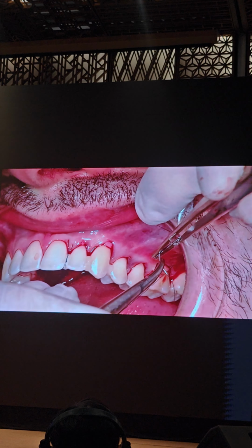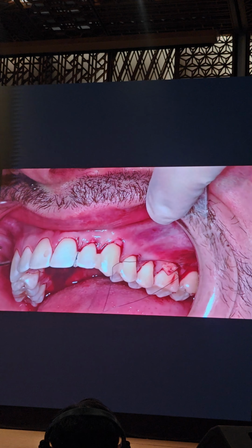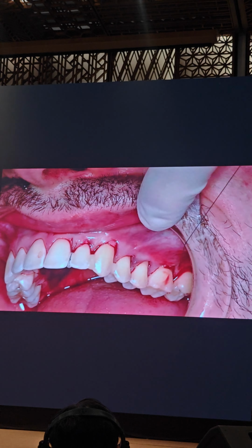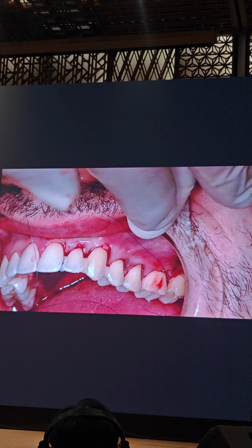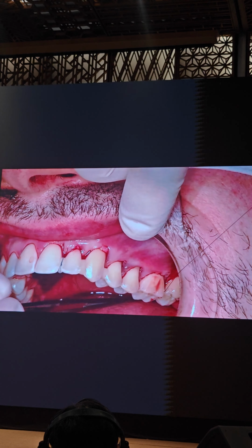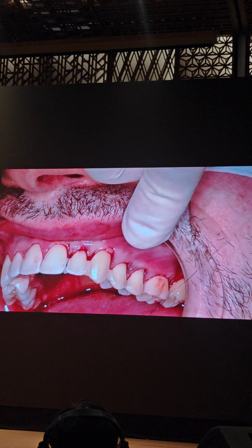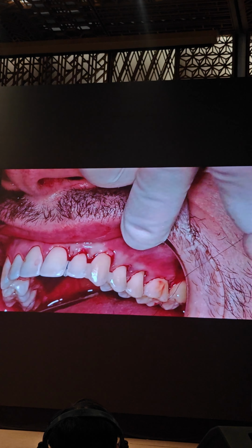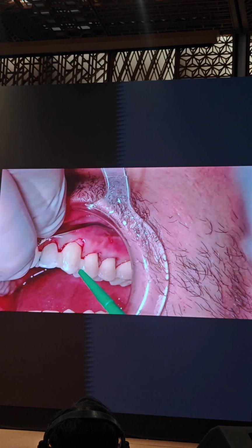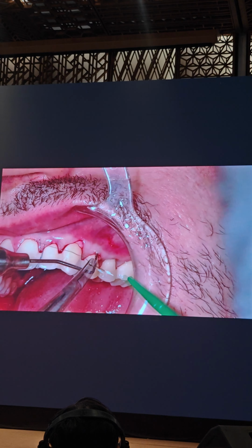At the other extremity of the graft, it's actually exactly the same procedure. And then, at every proximal space, you will add new sutures.